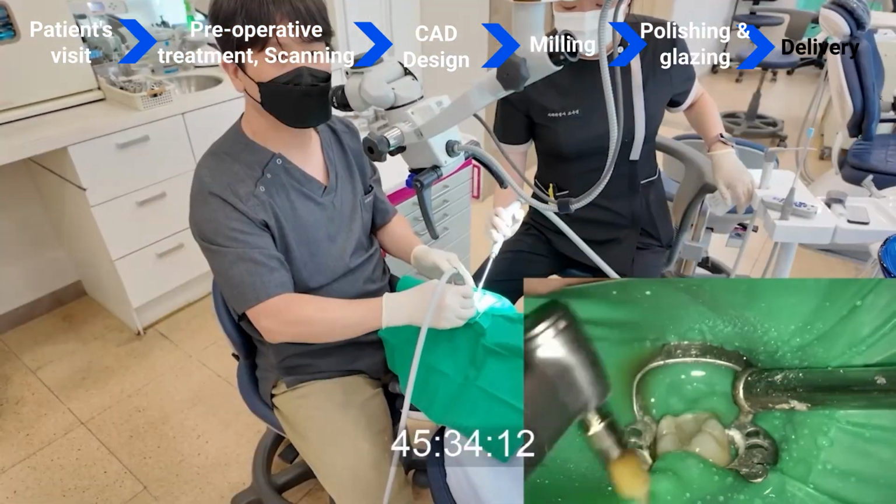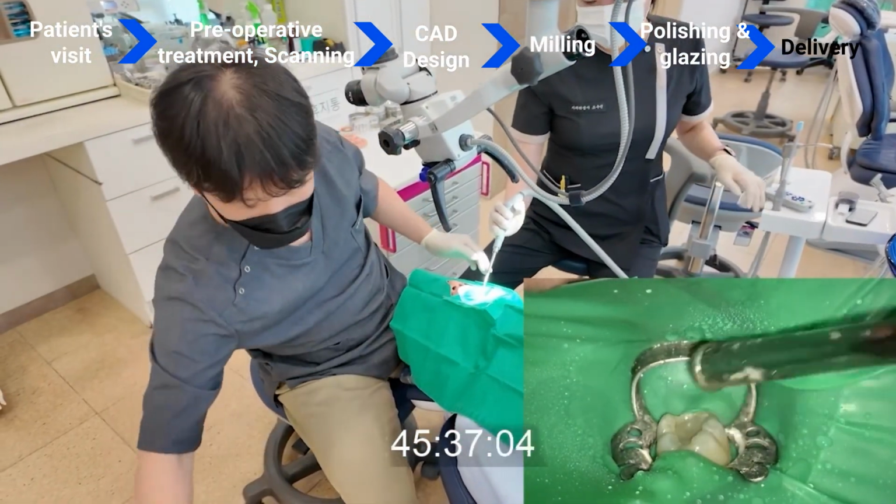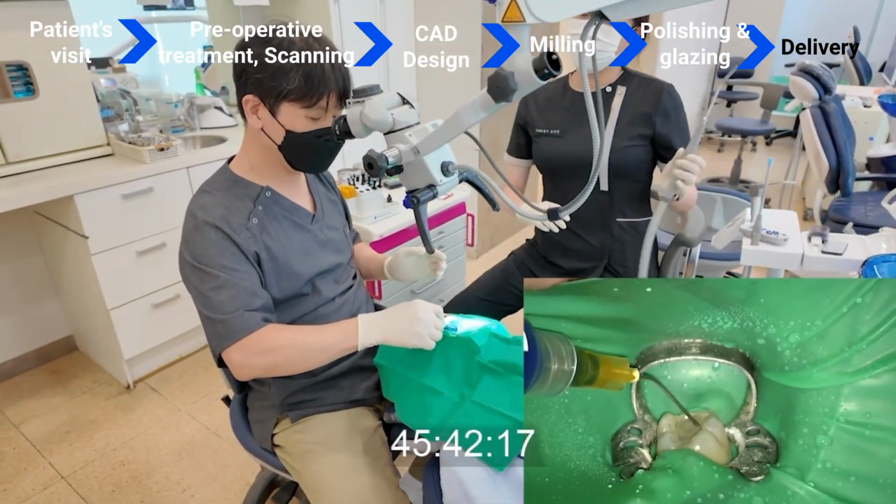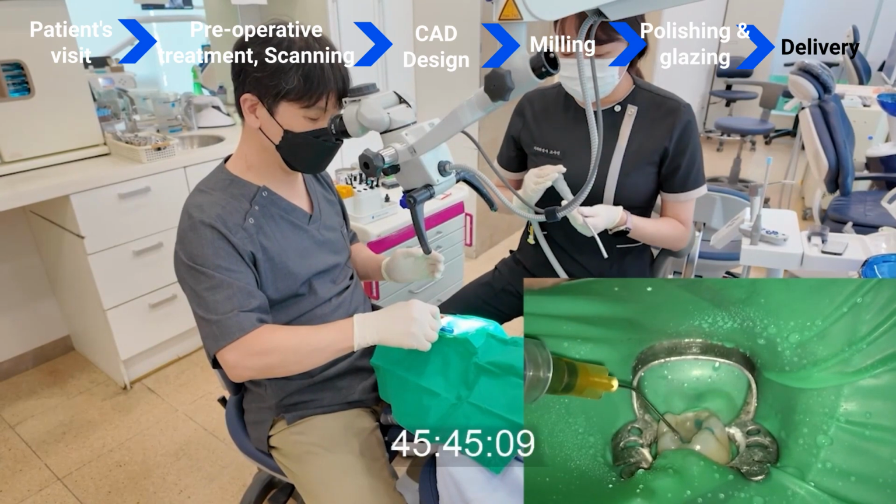Back at the clinic, we reinstall the rubber dam and clean the cavity. We etch, rinse, dry, and apply a bonding agent.